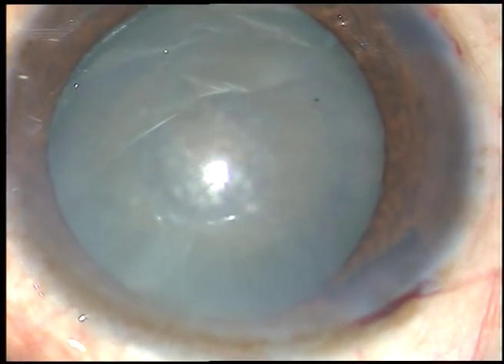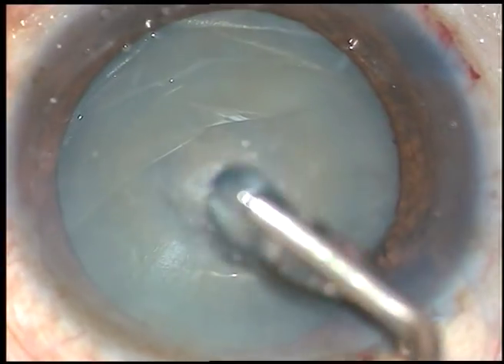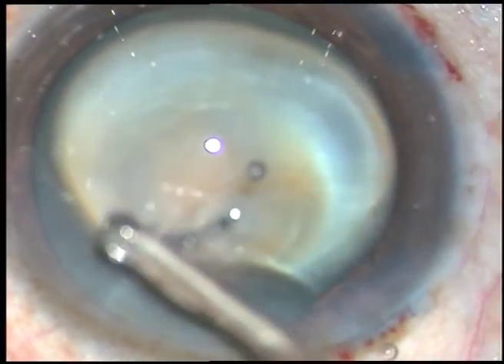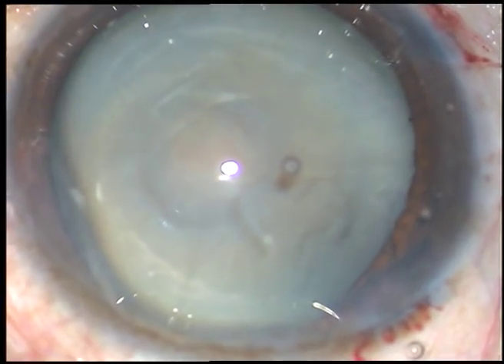Now, viscoelastic substance — 2% hydroxypropylmethylcellulose — is injected into the anterior chamber. It is sprayed over the corneal epithelium and it improves visibility.